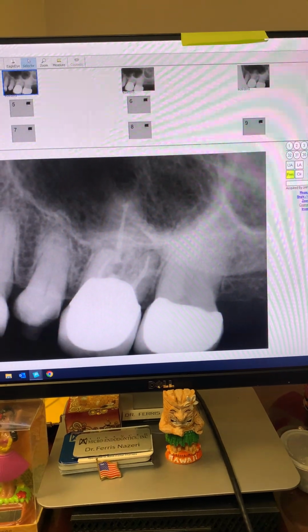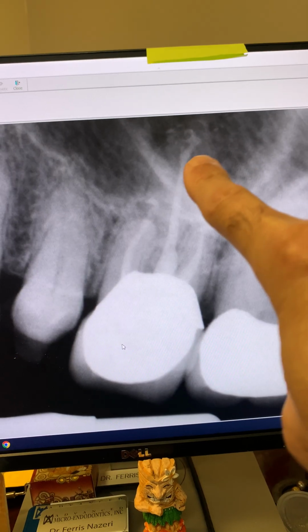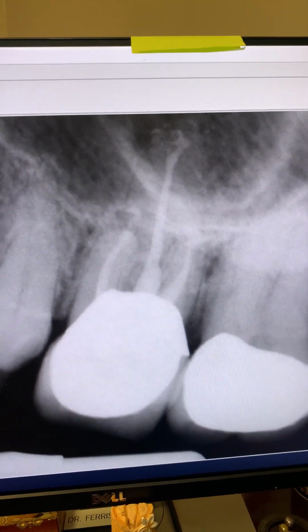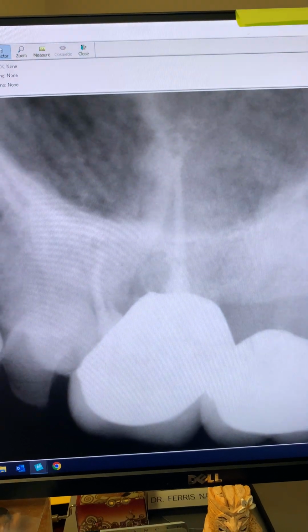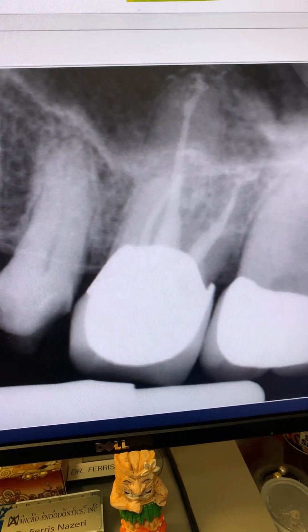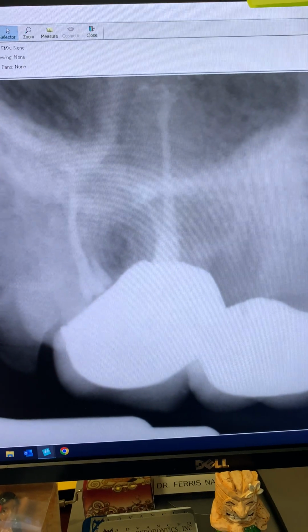Take a look. I was able to regain patency in the palatal canal there, distal buccal there, MB root there. For the life of me, and you can see the periapical lucency, I found a missed MB2, but I just could not instrument it any further than that. As I said, she was at the time 83 years old, so definitely a calcified MB2 canal system, and I just could not get it patent. And again, you can see the periapical lucency associated with the mesial buccal root there. And again, here you can see this is as far as I could go.